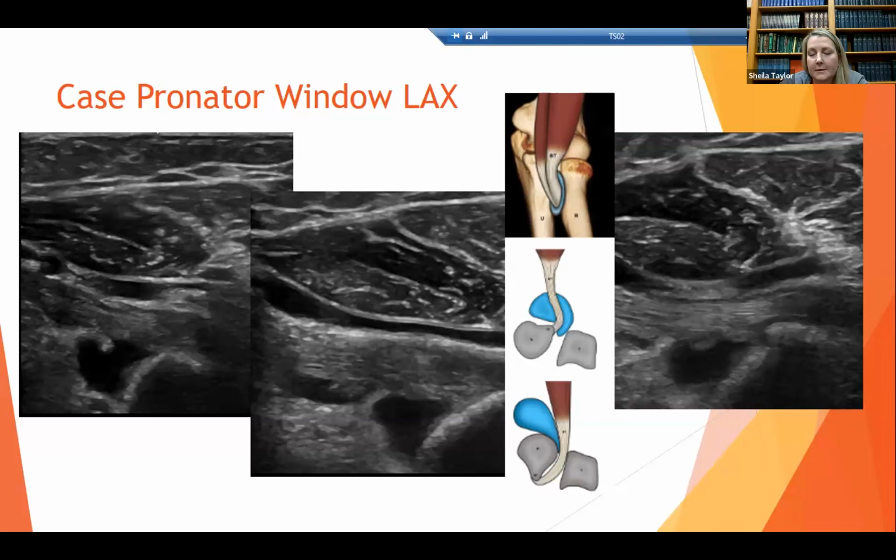Yeah, I can give my thoughts. I think it's probably a secondary change. She probably started out with microtrauma to her biceps tendon, so tendinopathy and then partial thickness tearing, that then leads to that spurring change, rather than that spur, that abnormality, causing the tendinopathic changes, which then inflame the bursa. That's my take. But again, I haven't seen a ton of these, to be honest.